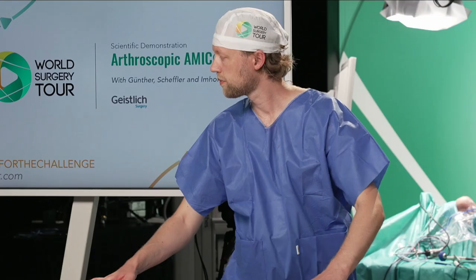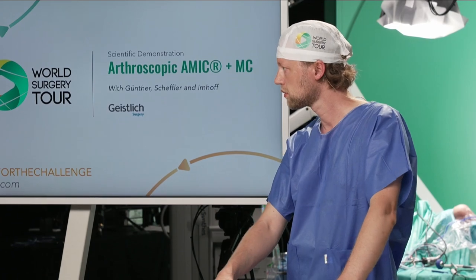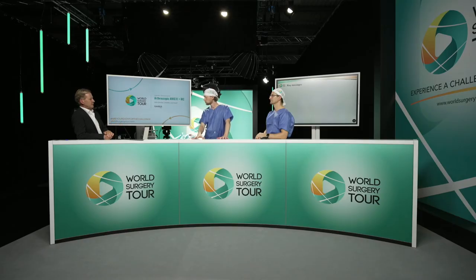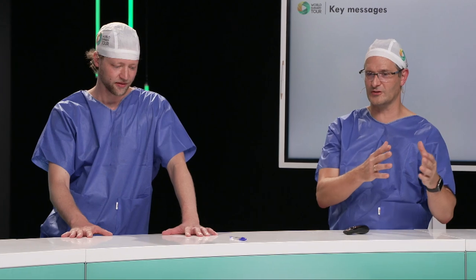Yeah, new technique. Now you have drilled or punched through the subchondral layer, and we have some stem cells coming out. Do we need this or do we not? So we should always argue with evidence. What the AMIC procedure, a combination of microperforation plus a membrane, has been shown, even in long-term data, is a very successful outcome.